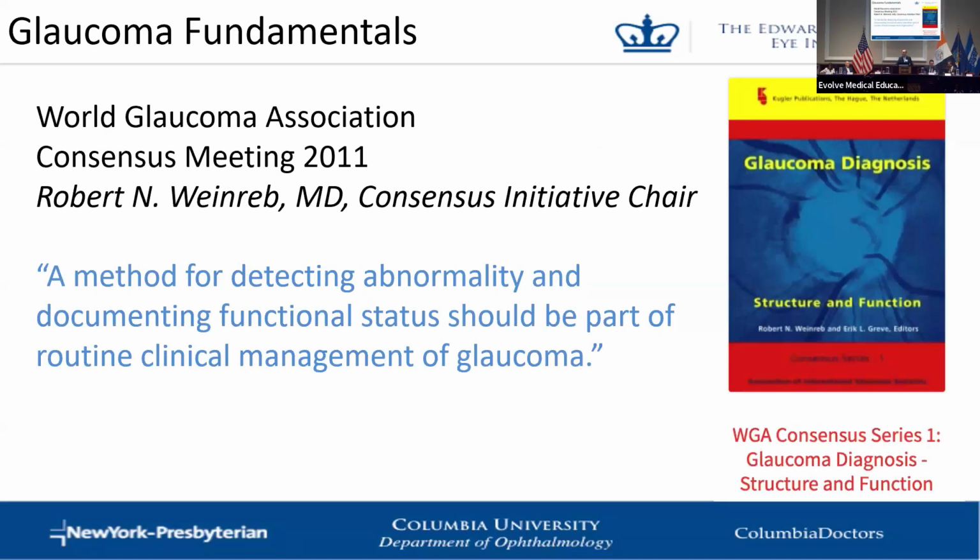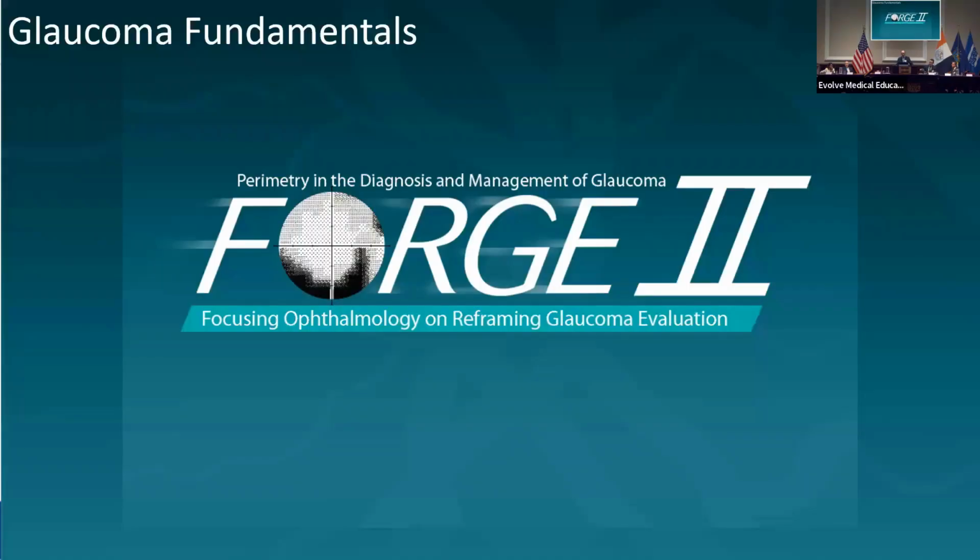There are some basic principles in ophthalmology and in glaucoma. This is from the World Glaucoma Association Consensus Series that's chaired by Bob Weinreb. The very first one stated that a method of testing visual function is critical for the diagnosis and management of glaucoma. I also point you to this basic course called Forge, which was something that we created, Bob Weinreb, myself, Jack Chaffee, and others, looking at visual fields.